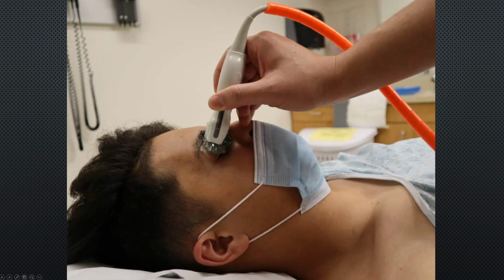So here's a picture of the basic positioning and what probe we're using. We usually have them in a supine, lying flat position. We have them closing their eyes. We put plenty of eye gel. You can't put too much. Just put on a ton and then use that linear probe. That's the best probe to use.